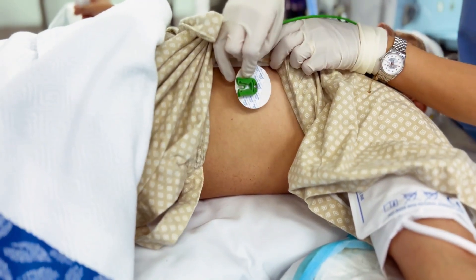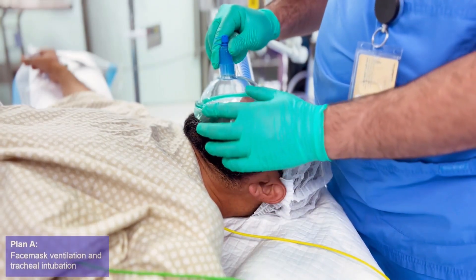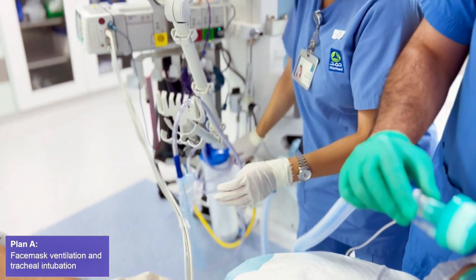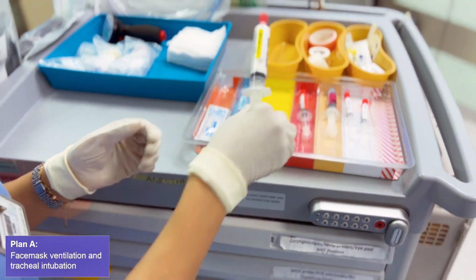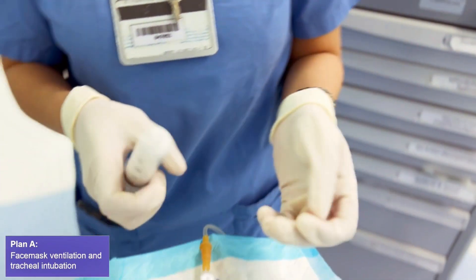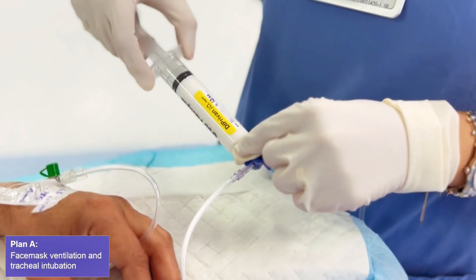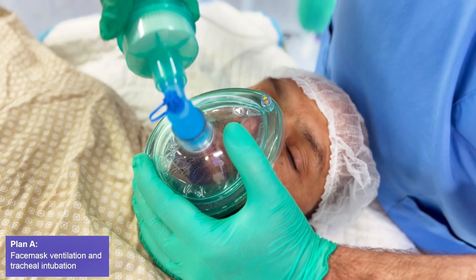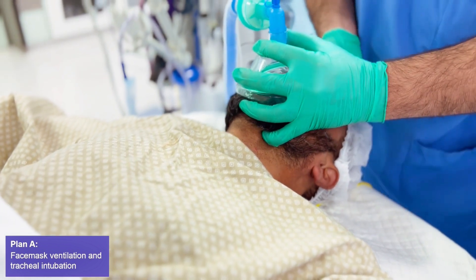It's a typical day — 7 in the morning — and we are about to take our first patient for surgery into the operating room. Once the patient is inside, secure the monitors and check vital signs. Pre-oxygenate the patient and keep a suction unit close to the patient's head. After adjusting the table height to a comfortable position for intubation, induce the patient. Once they are asleep, optimize the patient's head and neck to ensure optimum face mask ventilation.